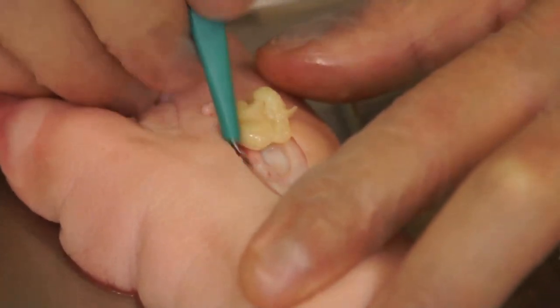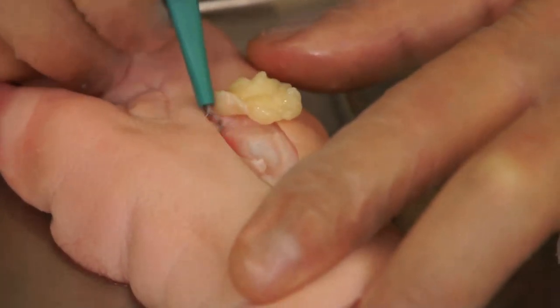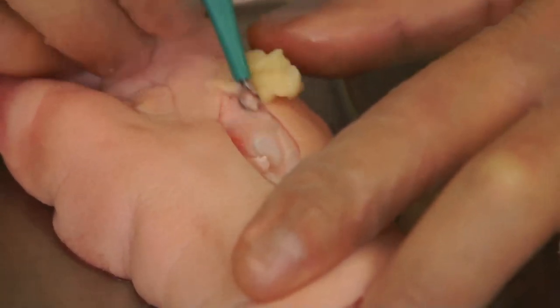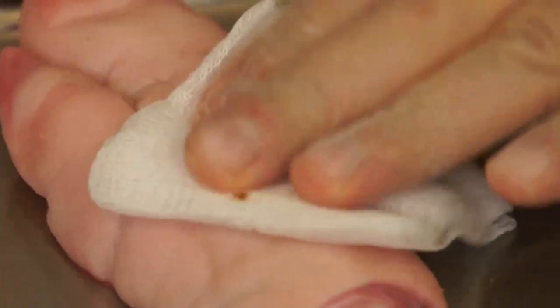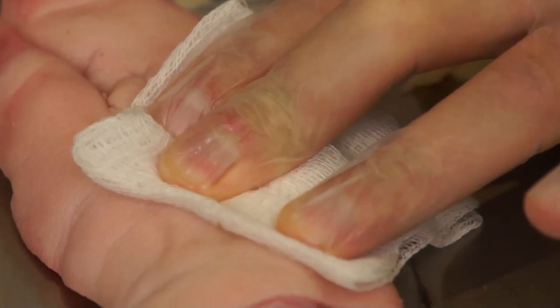As the debridement progresses, you'll see that the yellow necrotic tissue is removed. Any underlying capillaries that are bleeding can be easily controlled with pressure, and the wound can finally be cleansed with saline to remove any loose debris.